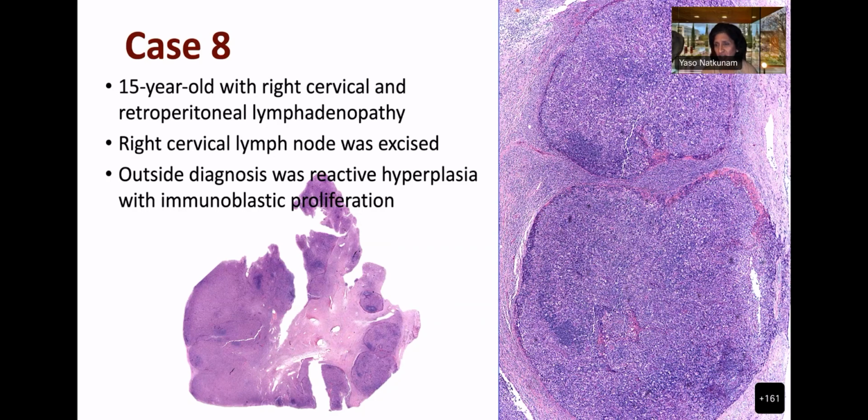And this is a higher magnification of the nodular part. So I have expanded this part here. Does somebody want to tell me what you think?